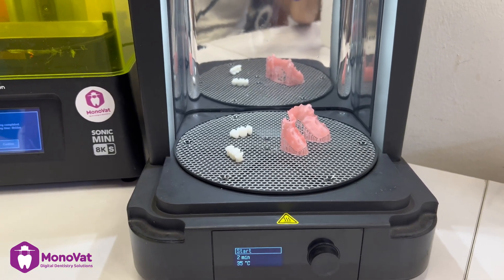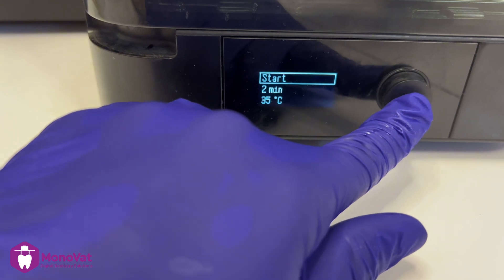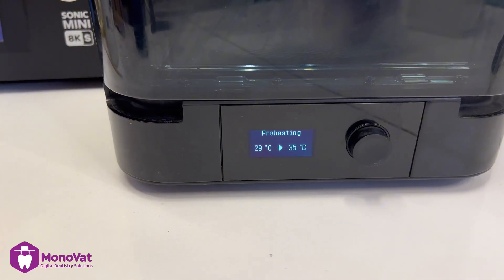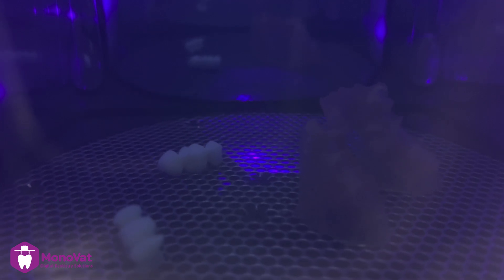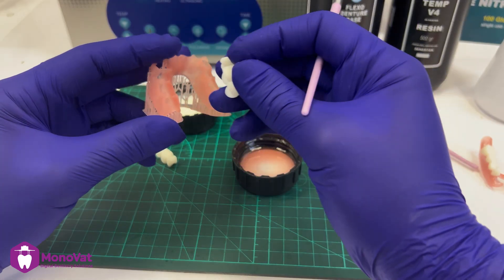I will use a Formlabs cure machine for two minutes at 35 degrees Celsius for the first curing stage. For a different device, refer to the company recommendation.